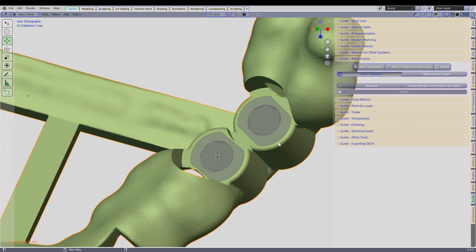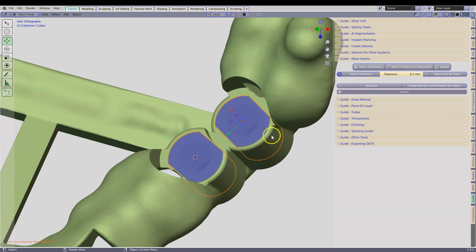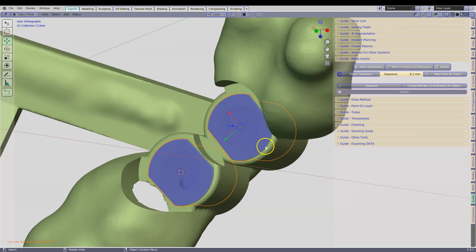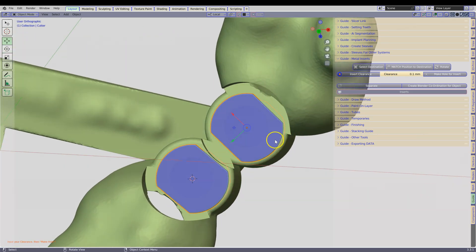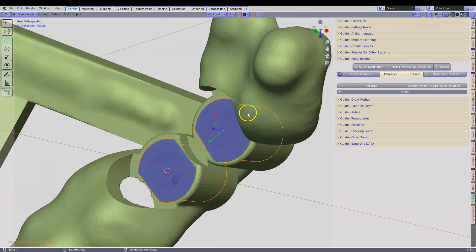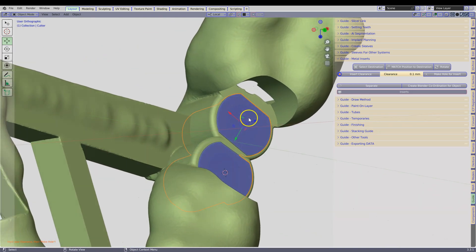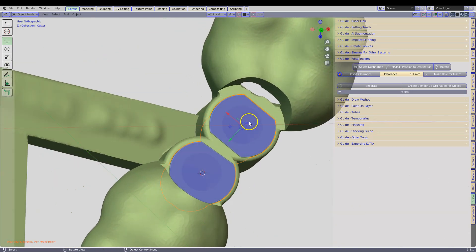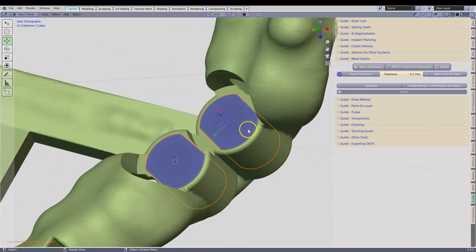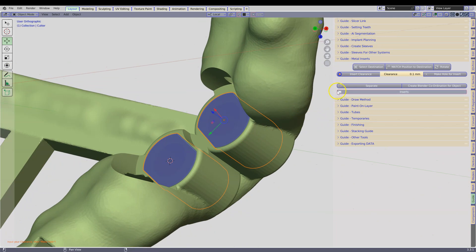The following is going to prompt us to put a clearance between the cutters and the actual guide. This will depend on your printer resin combo. So if it is too tight or too loose you can adjust it over here. Click on Make Hole for Insert.